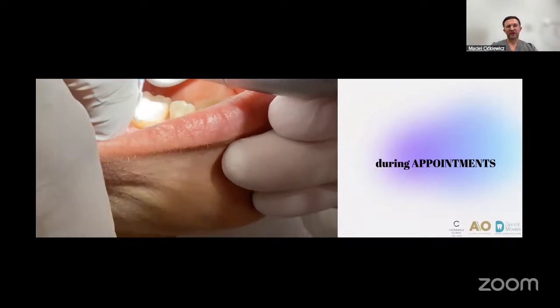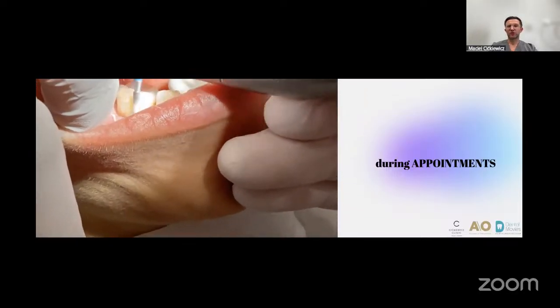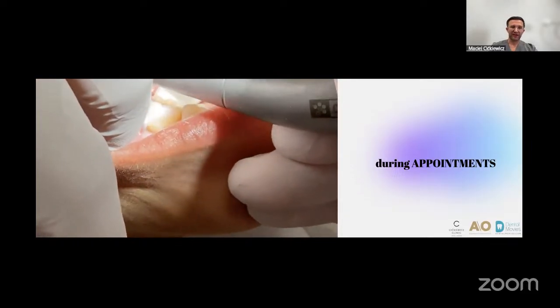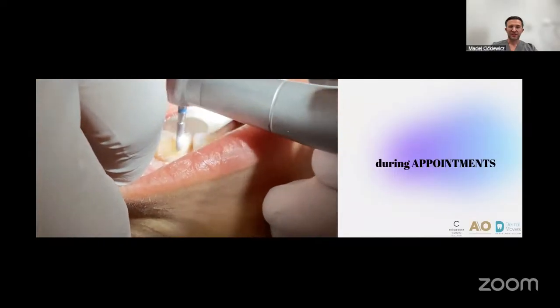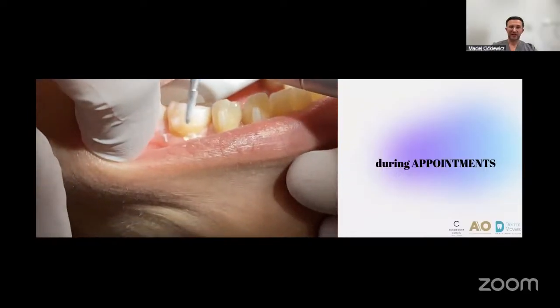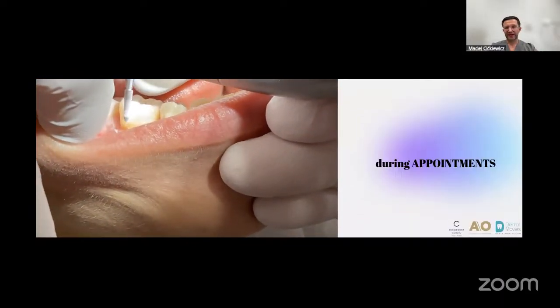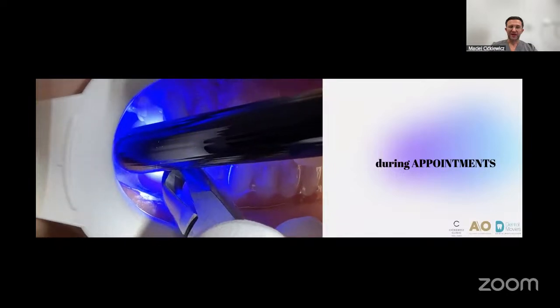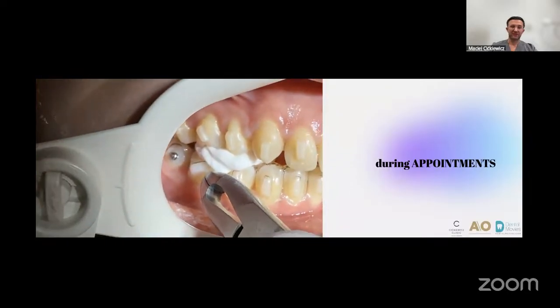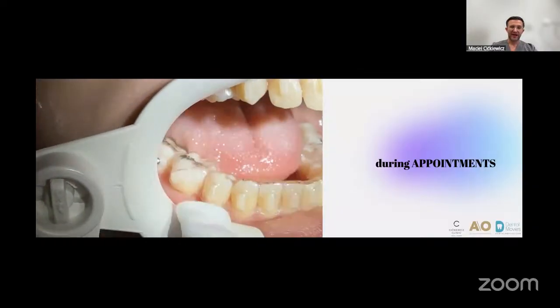So if we connect all the dots here in the workflow, and we try to do this communication through Dental Monitoring or something like that virtually, it will not work because these are static photos, static elements of the analysis. So if you want to create good data and analyze anything, it's better to analyze on site on the visit, because then you can decide what to do with the other aligners and how to behave.